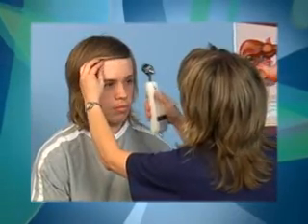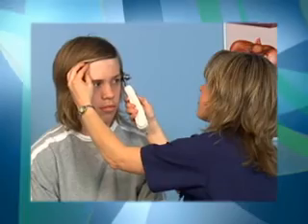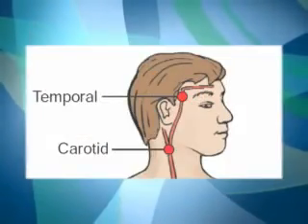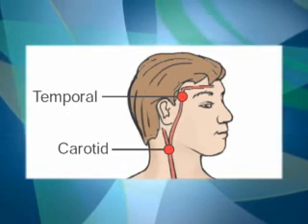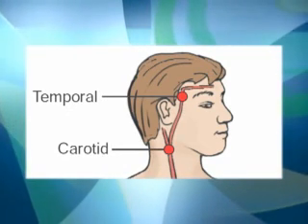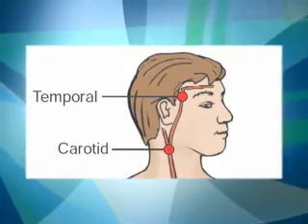The temperature on the forehead can be measured with the temporal artery thermometer. This is a convenient site for patients of all ages. The temporal artery runs across the forehead and down the side of the neck. This major vessel is very close to the surface, providing an ideal site for temperature measurement.